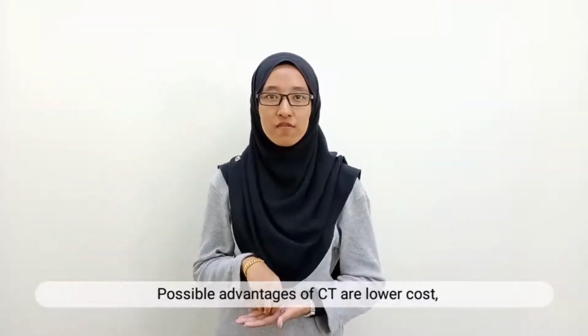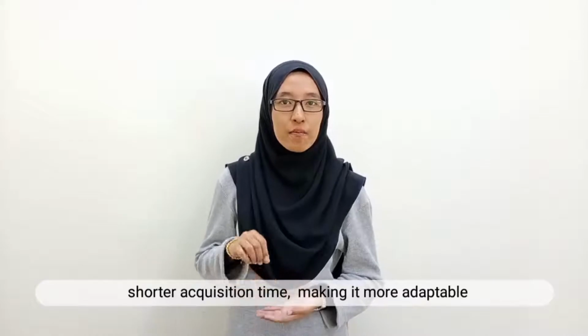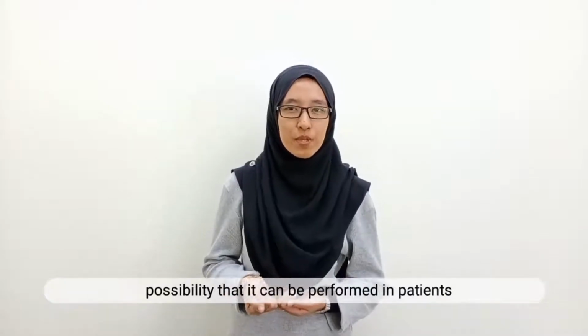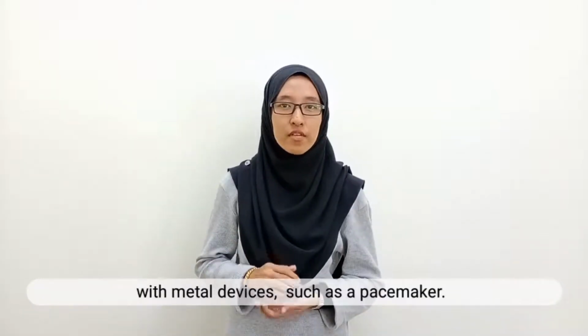Possible advantages of CT are lower cost, shorter acquisition time, making it more adaptable to patients with poor compliance, and the possibility that it can be performed in patients with metal devices such as a pacemaker.